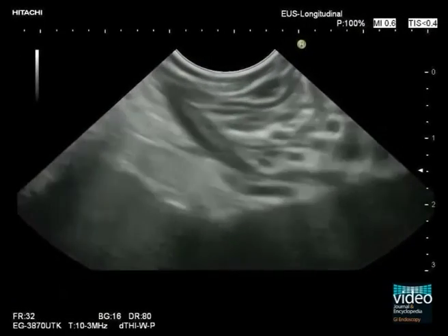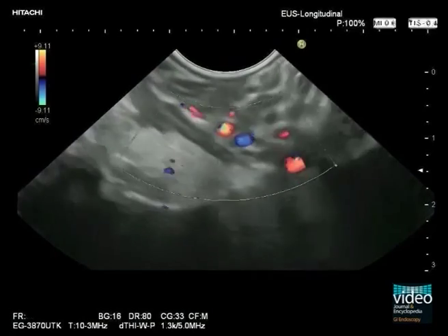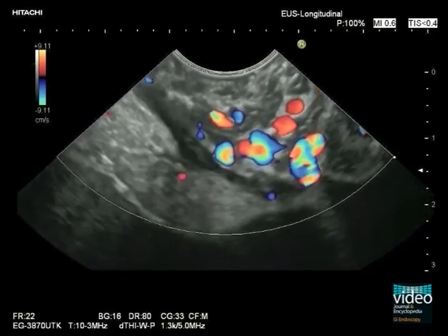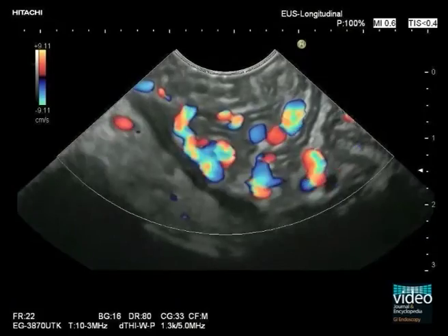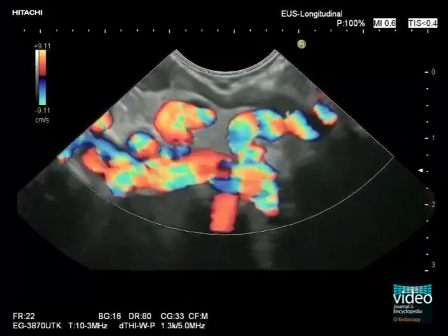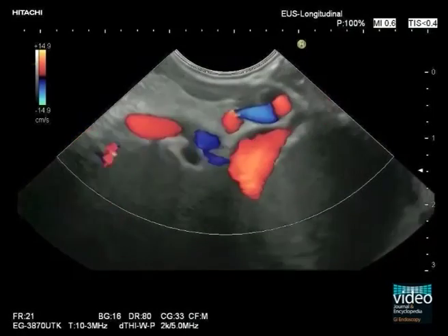In this case, gastric varices originating from large-sized perigastric collaterals are visualized between gastric fundus and splenic hilum. The patient was admitted to hospital only 2 weeks before due to a first attack of severe alcoholic pancreatitis. Again, the splenic vein is completely occluded by a hypoechoic inflammatory pseudotumor of the pancreatic tail. Flow can only be detected in the splenic artery. Positive identification of the splenic vein is not possible.